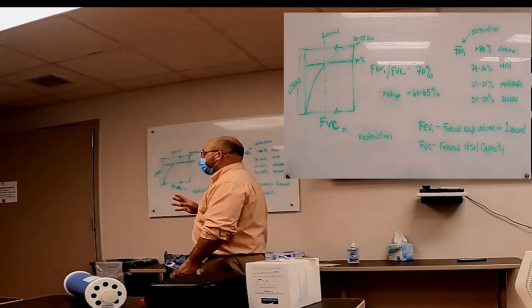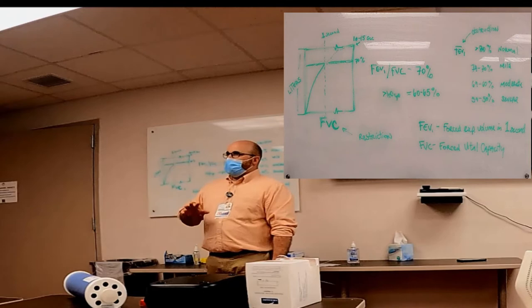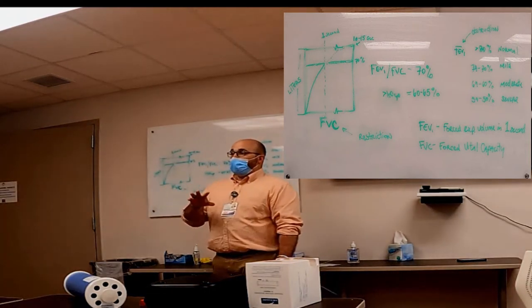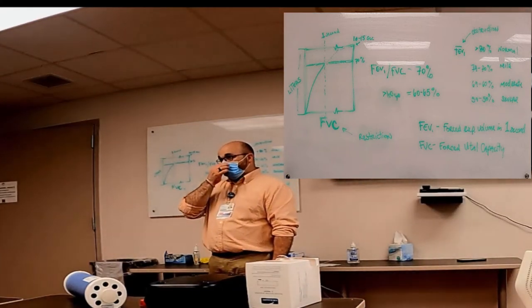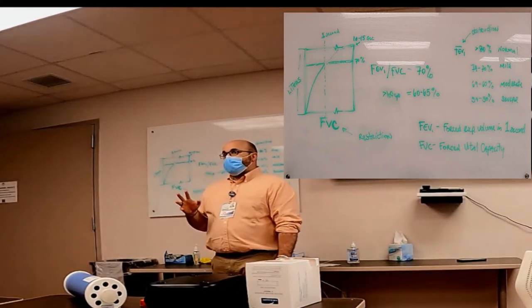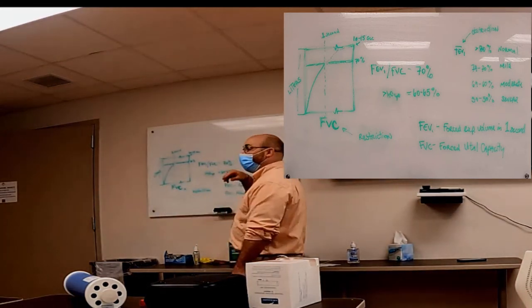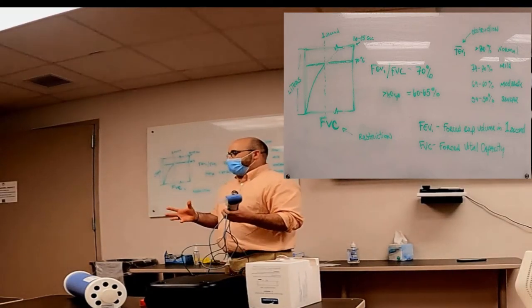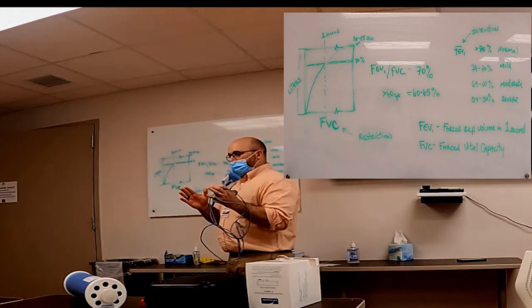So there is some confusion about spirometry versus PFTs. PFTs, usually when you're talking about that, that's pulmonary function testing, and usually we're talking about a full pulmonary function test. There's a ton of tests that we do with that, which takes like 30 to 40 minutes. Spirometry is just this one forced vital capacity, this FVC, that one blast. So okay, spirometry is not a PFT. This is spirometry, and it's a smaller area.